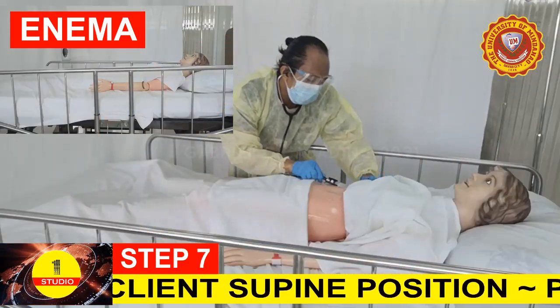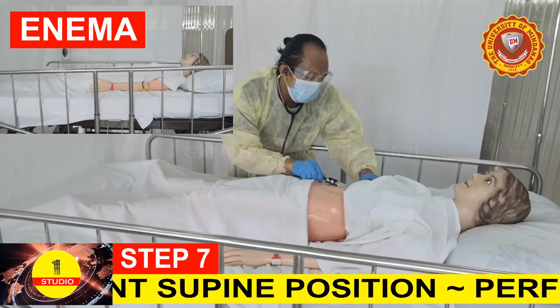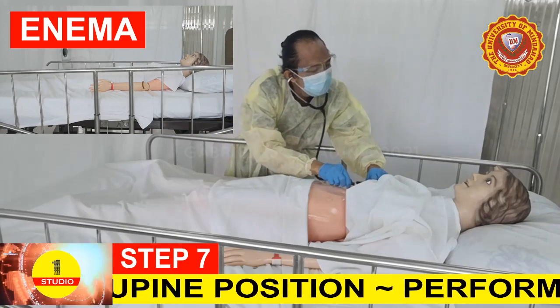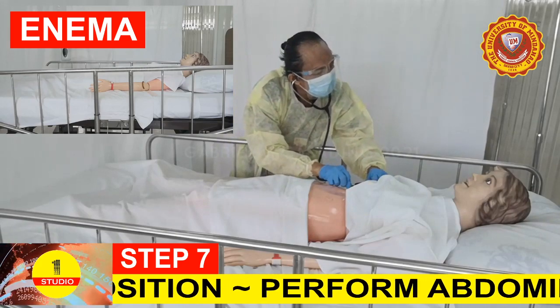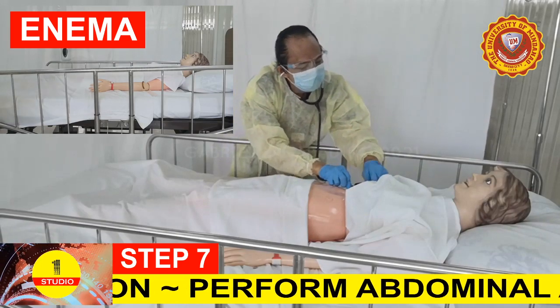Step 7. Put the client in a supine position and assess the client's abdomen before fleet enema administration.